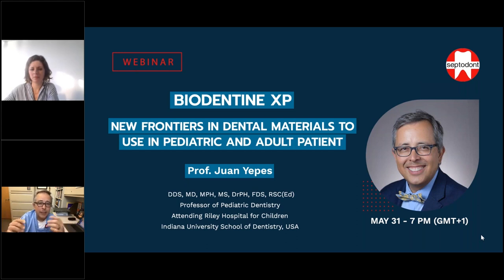In fact, you know what? You probably don't need to remove the decay. If you get a good seal and you use Biodentine, which is a highly biocompatible material, it is going to help you remineralize the dentin, so you probably don't need to do it. But the bottom line is don't remove a lot, so you don't expose the pulp. I know it's a long answer, but.